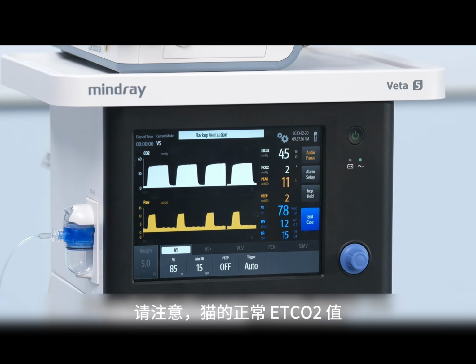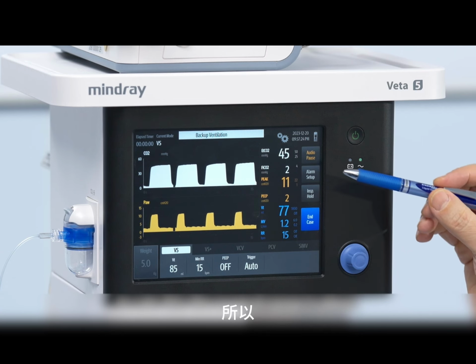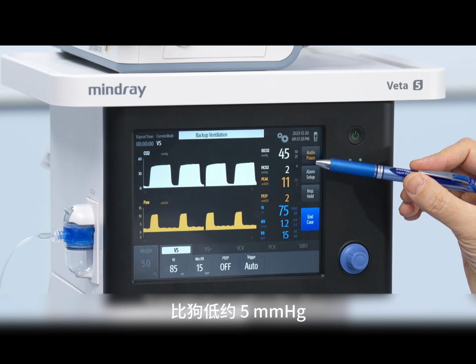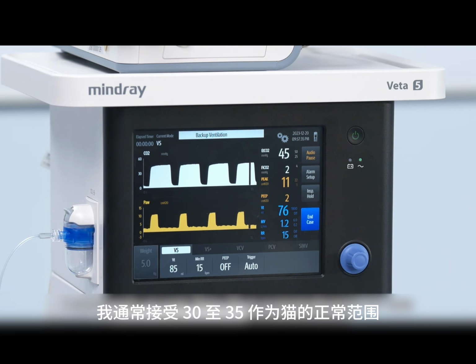Be careful that the normal end-tidal CO2 values in cats are lower than in dogs. So in cats, the normal range is about 5 millimeters of mercury lower than for dogs. I commonly accept 30 to 35 as a normal range for cats.